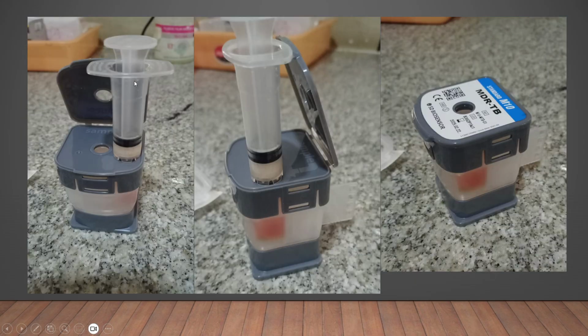Once you put the sample, make sure that you put the piston and press it down, because many times what happens in the filter is that some amount of fluid gets trapped or stuck. So to prevent that, you just pull it. Once you pull it, then close it. Remember, you should not tilt it, and you should not move it very fast. So handle it very carefully now. It should not fall or anything like that.